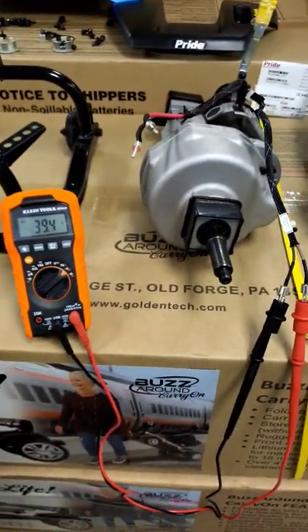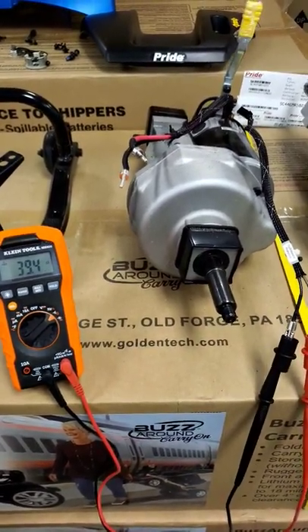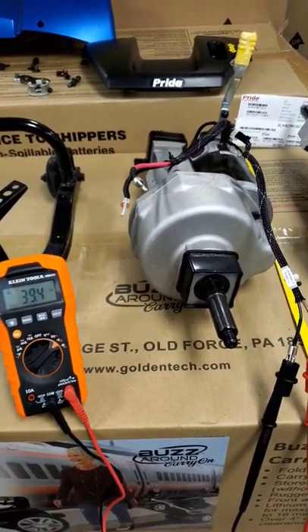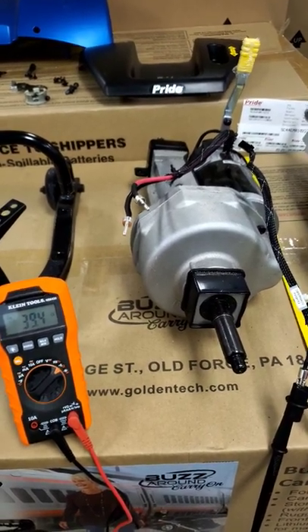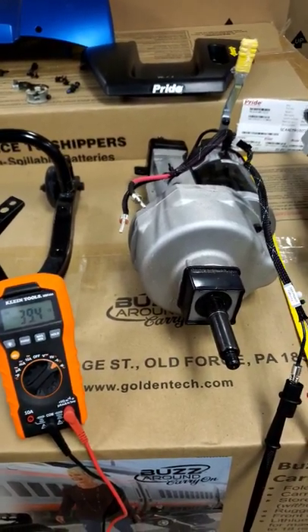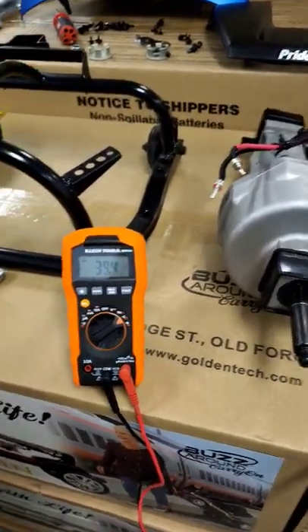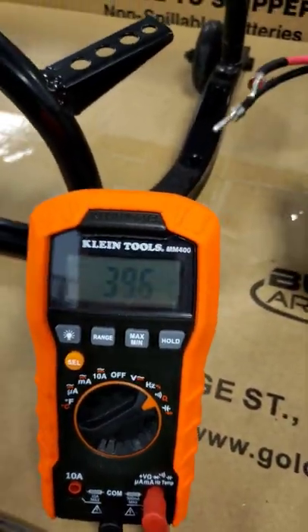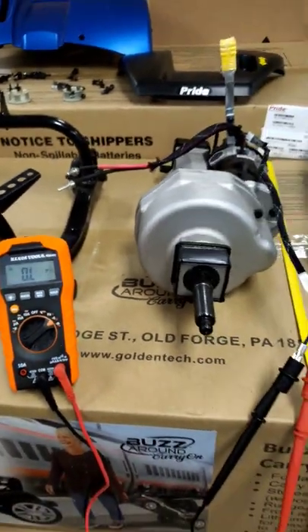I've been told by Pride Mobility that the proper range for a functioning electronic brake is going to be between 30 and 60 ohms. Right now, we're sitting at 39.4, and what should happen when I put this into neutral is that we should get an open circuit. So let's see what happens. And that's correct.